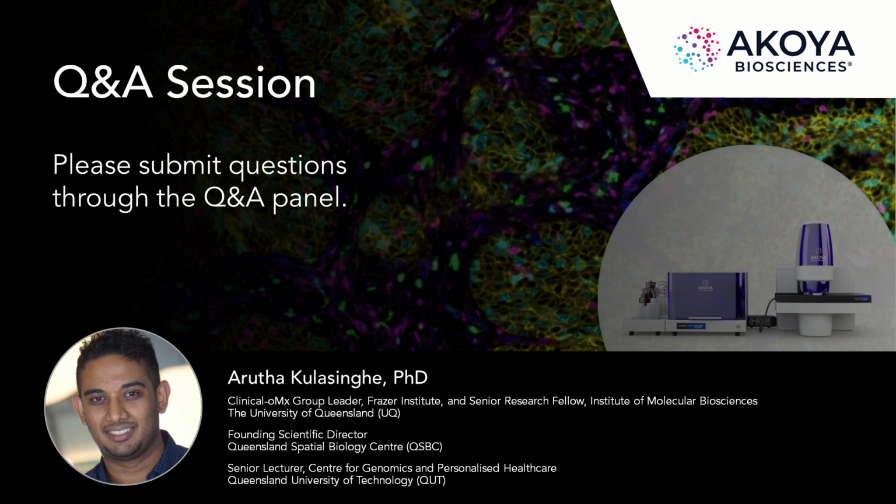But I think with the proteomics field, having assays between 6 to 100 plex that you can run routinely, robustly, reproducibly, in a high throughput manner on clinical cohorts in a timely manner, where you can go from sample to data generation and analysis within a timely manner. Ultimately, these assays need to be sample to read out within a couple of days if it's going to be clinically actionable. So I don't think it's all about plexity at the moment.